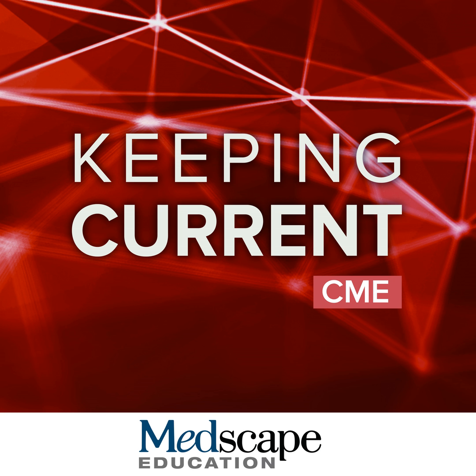And I'll go on to the next question: how do you report findings if you acquire both a gradient echo and susceptibility weighted imaging? So there are some practices that are doing ARIA-H assessment just with a GRE, some using just an SWI, and there's other practices that are acquiring both of these. And we are doing that and recommending that people use both sequences to provide one number of microhemorrhages, what you think to be the true number of definite microhemorrhages based upon the use of both sequences.